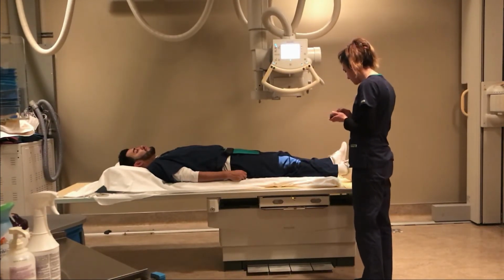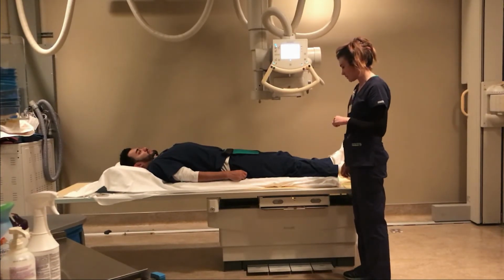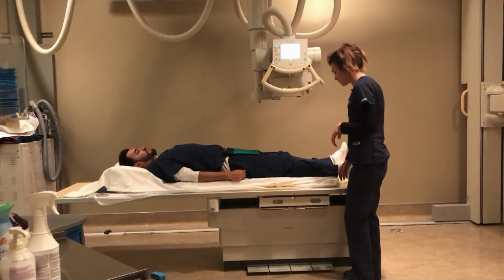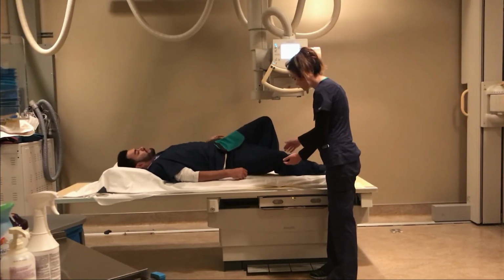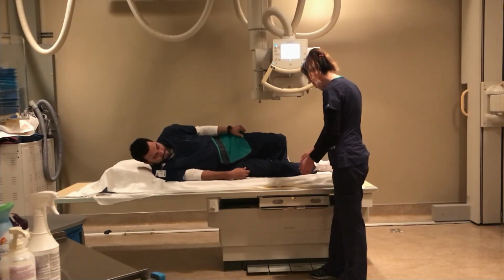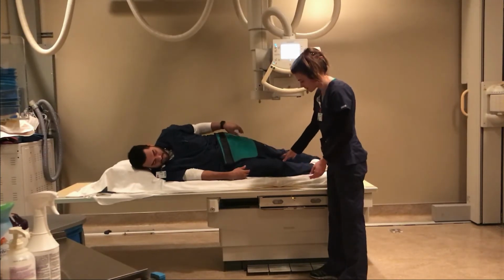So for the next one, it's going to be the lateral knee, and the central ray is going to be entering mediolaterally. So Phil, what I'm going to have you do is I'm going to have you turn a little bit towards me, and you're going to let this knee drop out towards me, and you'll just flex it about 20 to 30 degrees. So that looks good like that.